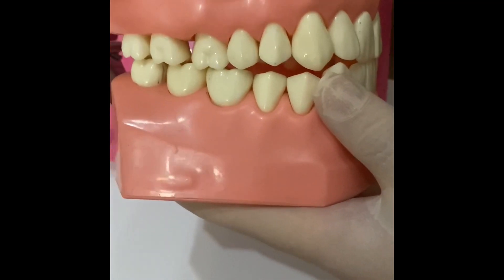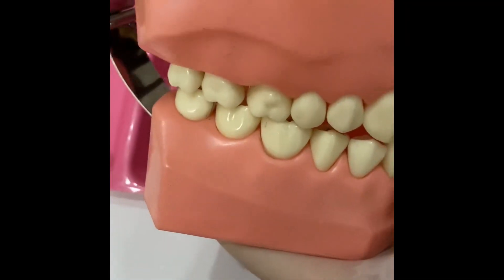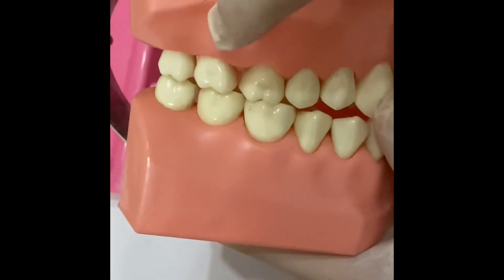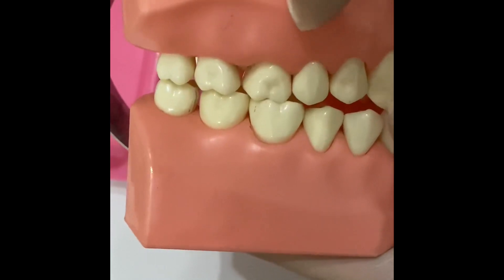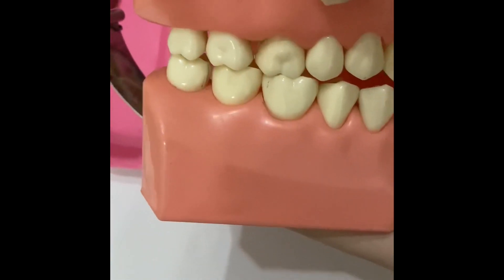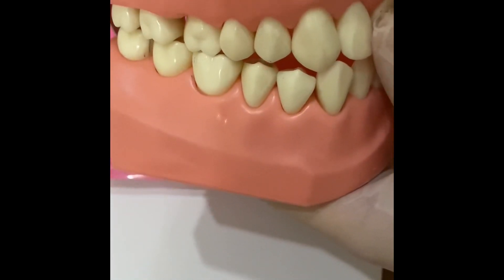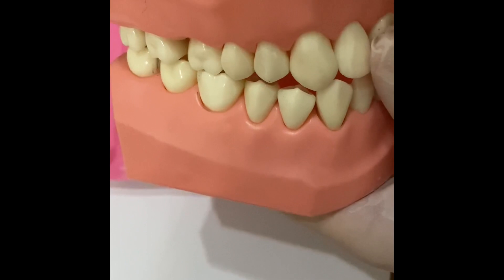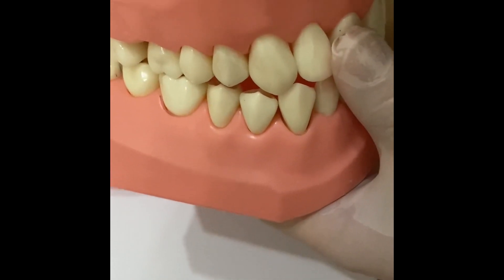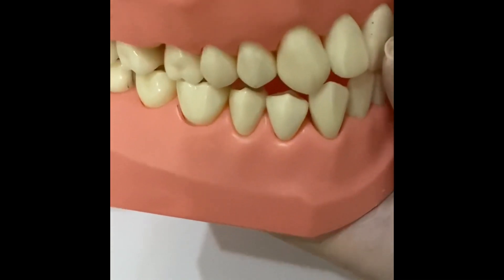In the case of infiltration, we give the anesthesia directly adjacent to the area we want to work. In the case of block, we anesthetize the main nerve that supplies the area.